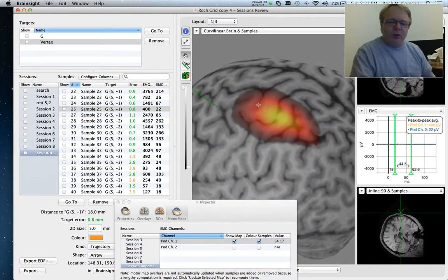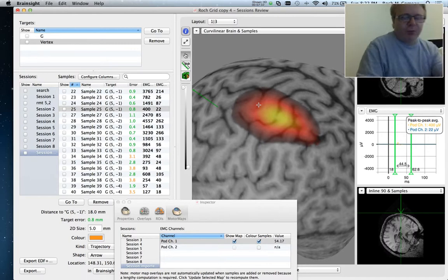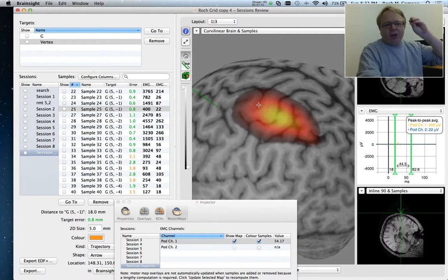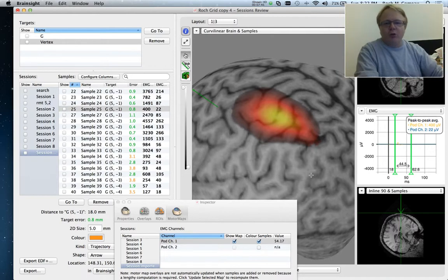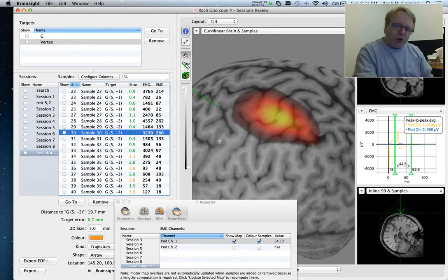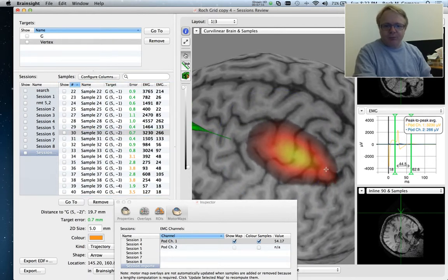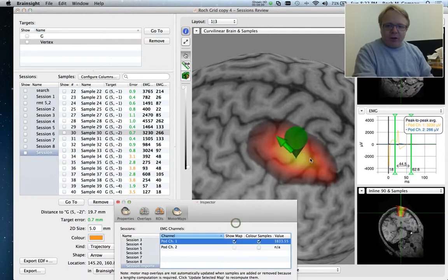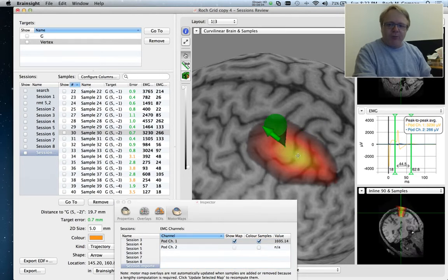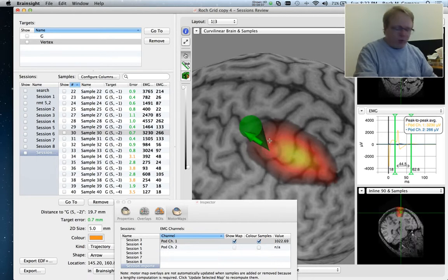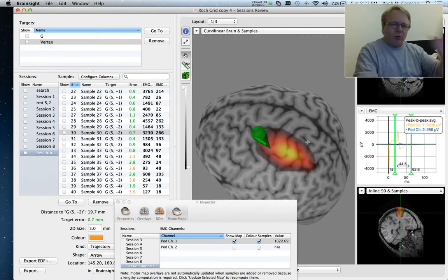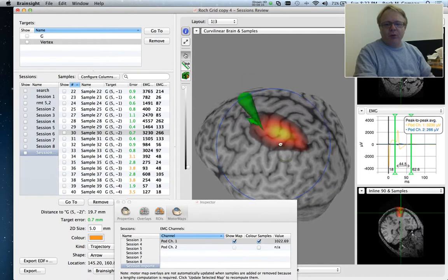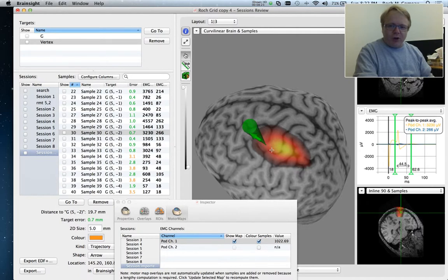So let me just turn off the actual samples here just to make it easier to see. So what we did is we gave each sample a full width half max. So a physical width as it were. And we projected those numbers into the volume. And then we interpolated between all of these nodes. So between each grid node where we acquired an EMG value, we interpolated between all the neighbors. And that enables us to draw this map. So now we can easily see where the EMG was higher. And as I click on this view, we show the EMG value here. So it gives you a very visual representation of the EMG data we acquired. So when you perform an EMG over a grid, we can draw this EMG map onto the three-dimensional cortex. So now this allows you to very easily associate the EMG information with the underlying cortex that we were stimulating.